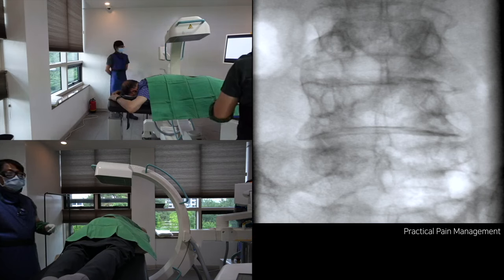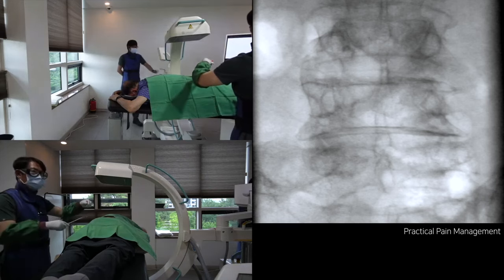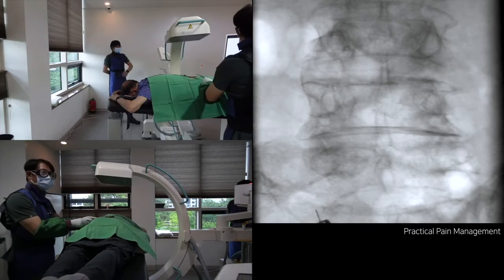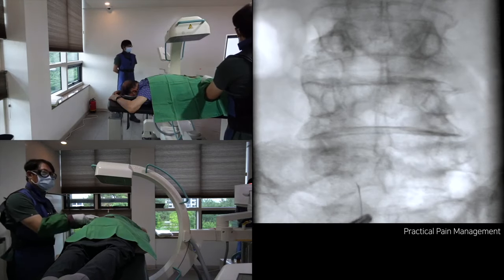It is an AP view. It shows a poorly defined border and sclerosis of the inferior joint margin of the facet joint. It looks challenging to me. It also shows transitional vertebra, Castellvi classification type 2A. I am not sure I will succeed in accessing the inferior capsule. Anyway, I will try the inferior recess approach first.